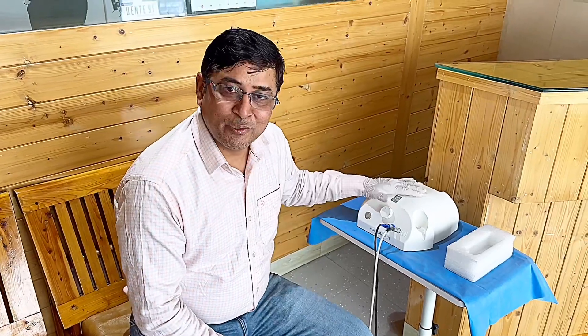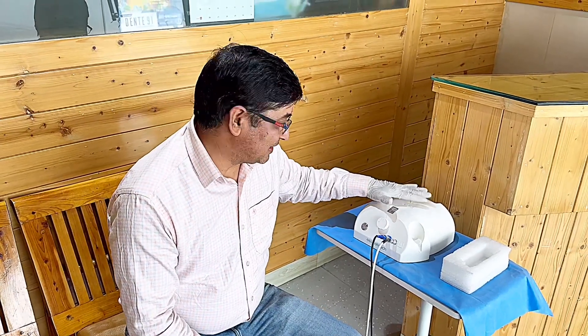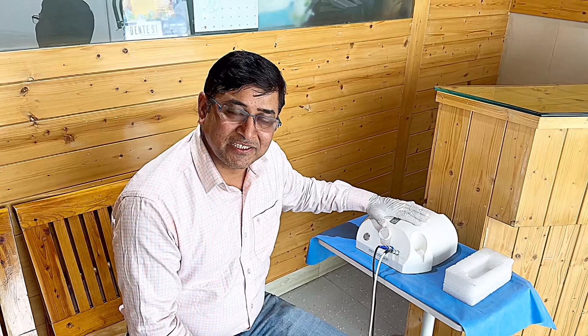I am Pradeep Bisht from Arujo Enterprises, Dehradun, Uttarakhand. Today we will be performing an extraction and then an implant.